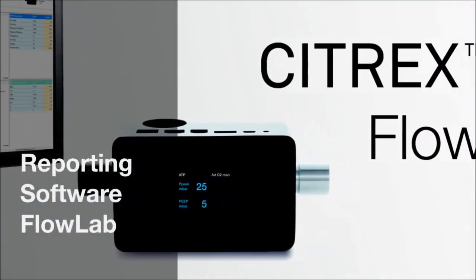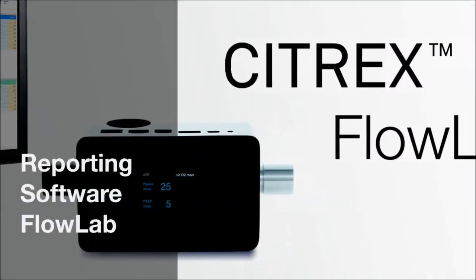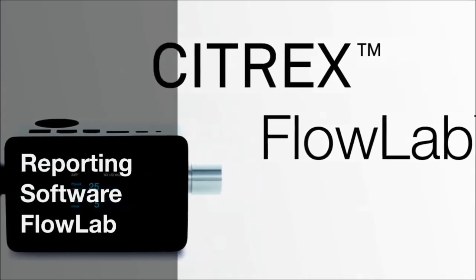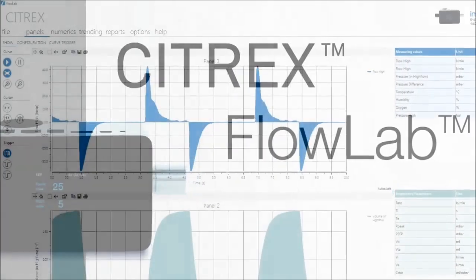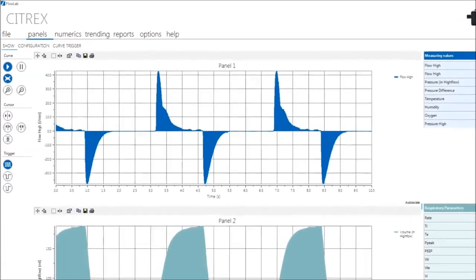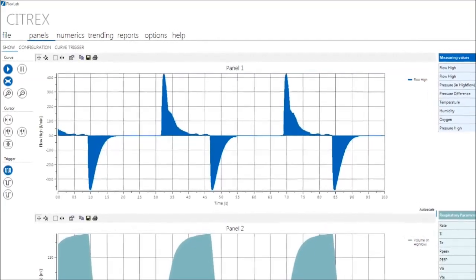The new analyzing and reporting software, FlowLab, is available for all gas flow analyzers from IMT Analytics.